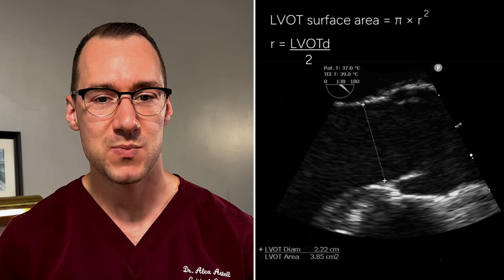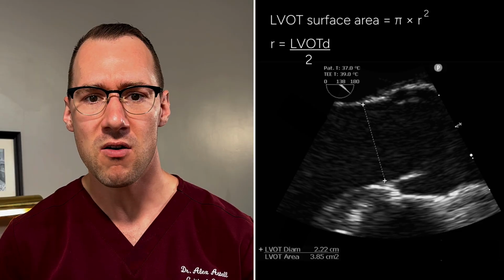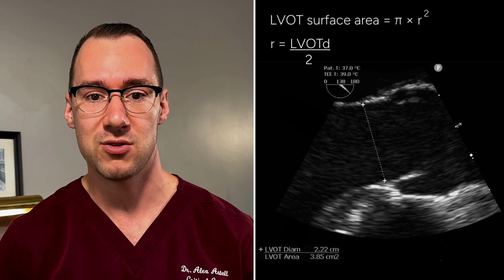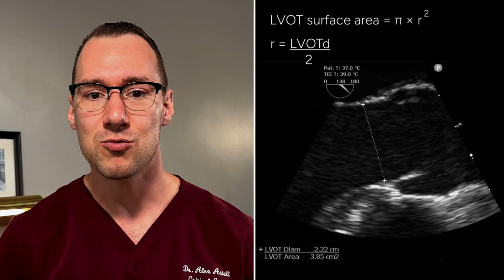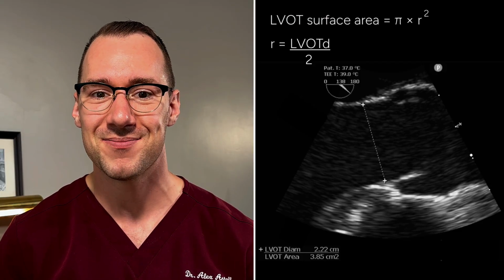The average for most people is approximately 2 centimeters. So if you're getting a value that's far off from this and your patient's not either very large or very small, you'll need to recheck your alignment and take several measurements to ensure accuracy.